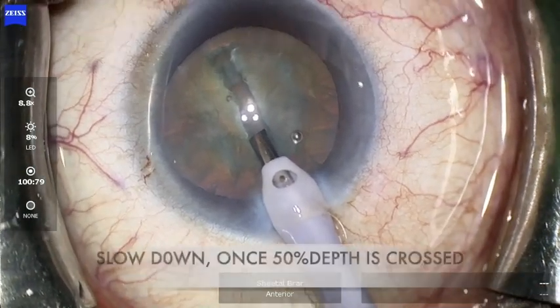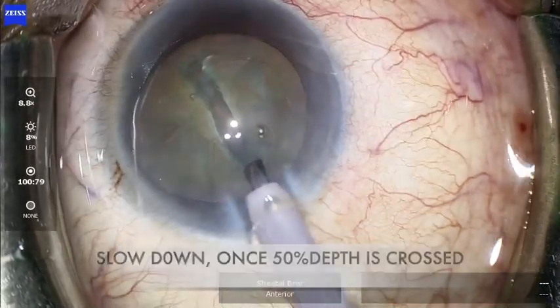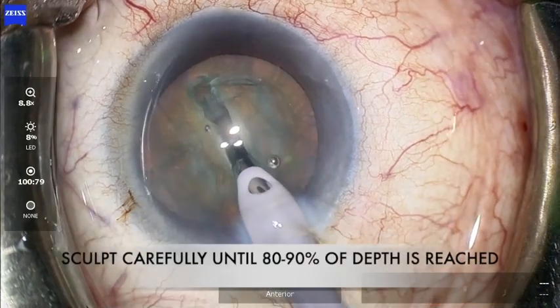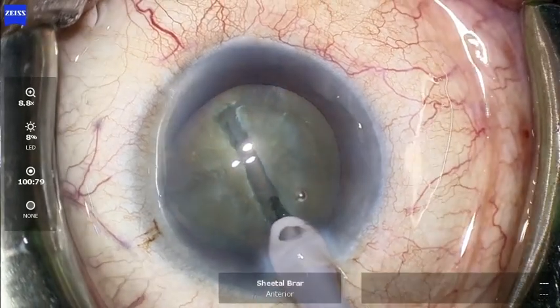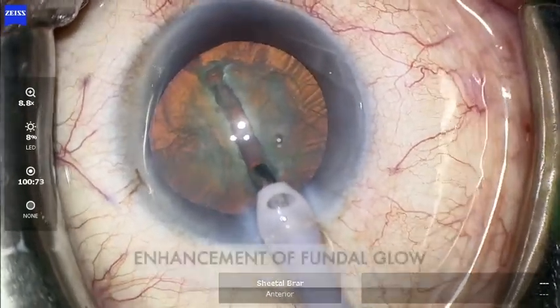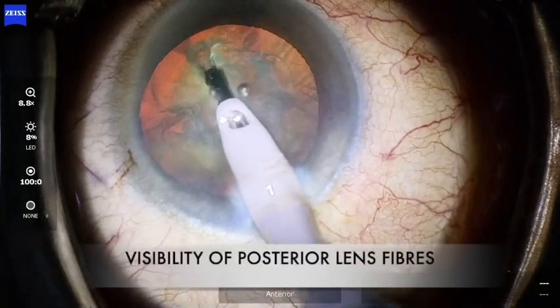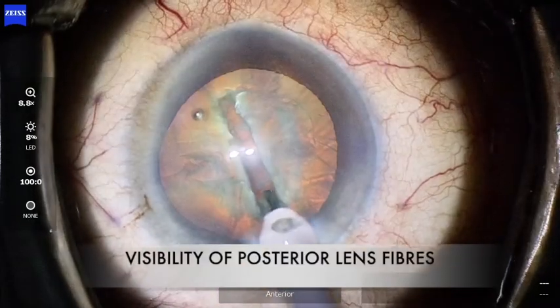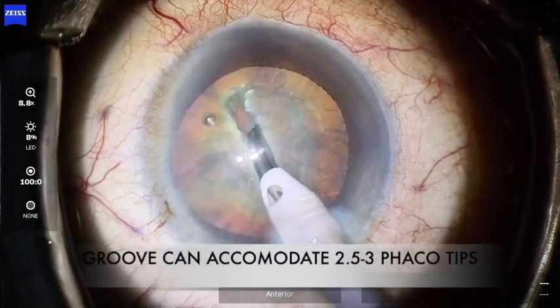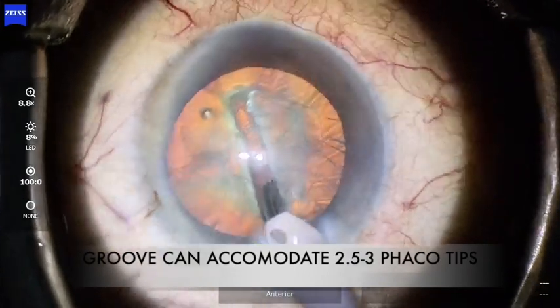However, once 50% depth of the nucleus is crossed, one should slow down and carefully try to deepen the trench further until about 80 to 90% depth is reached. This would be indicated by enhancement of the fundal glow, visibility of slightly rough-looking posterior lens fibers, and the fact that the groove will be deep enough to accommodate two and a half to three phaco tips within itself.